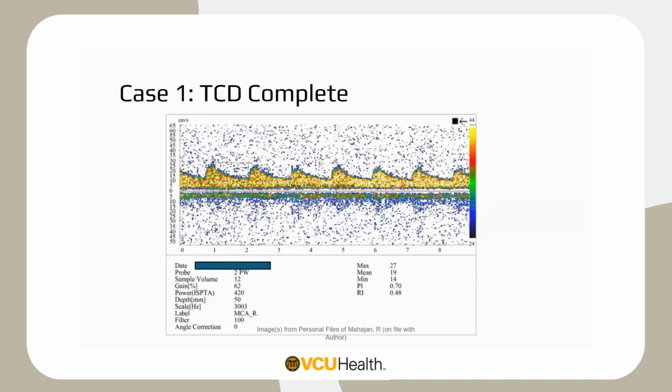Now we get to the main portion of the pathology. So in the right MCA, we notice a drastic change in the velocity and the waveform qualitatively. The direction of flow is normal. We see maybe some delayed flow acceleration, although it's close to normal here, but certainly it's a dampened waveform. The mean flow velocity is, it's a pulsatile flow, but it's certainly abnormal where it's low. And so we notice basically pulsatile flow with a low velocity and normal PI in the right MCA.